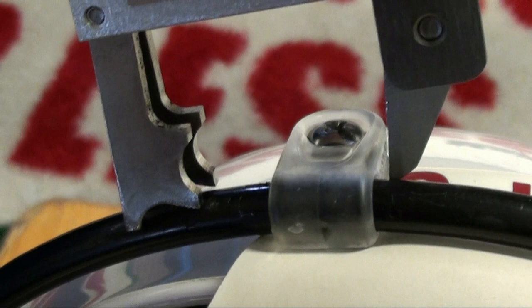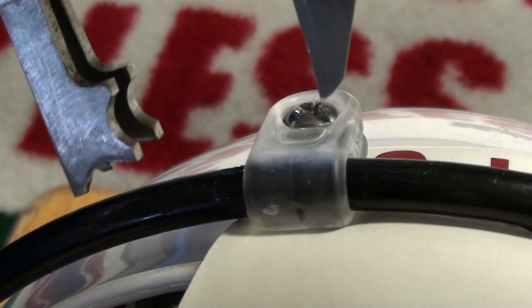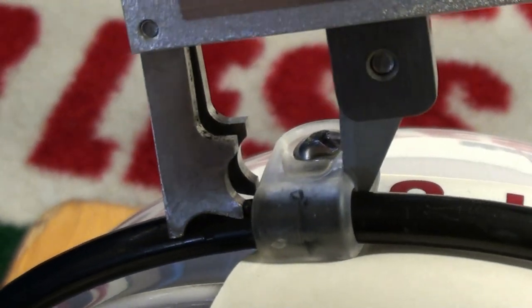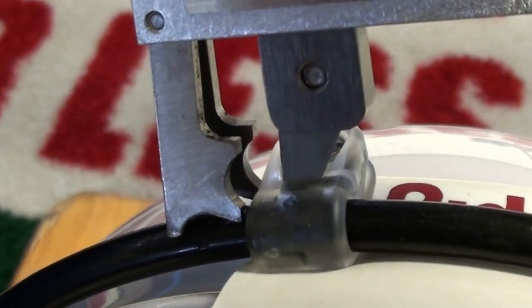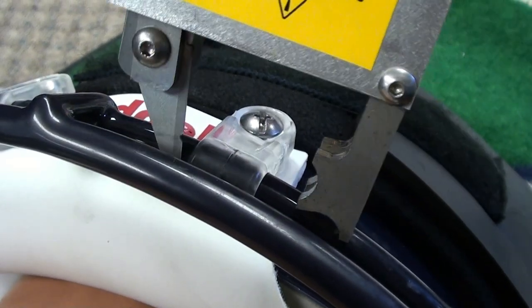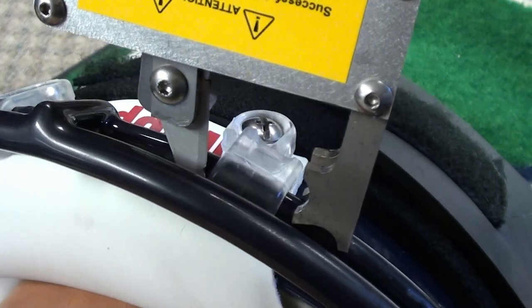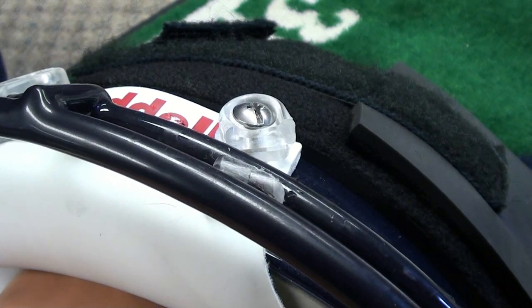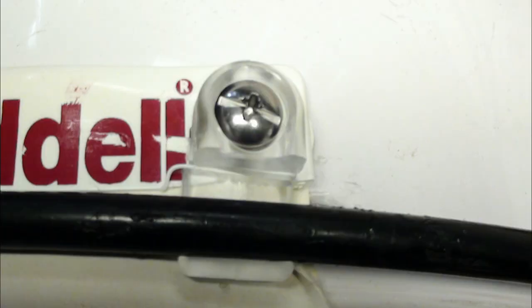You may elect to adopt a two-cut chasm nest technique for cutting through these forehead loop strap fasteners. Securing the anvil to the face mask bar using the superior chasm nest of the anvil on the face mask bar, reach the blade across the fastener, tip the blade forward to allow the anvil to grip the face mask bar, and cut the loop strap above the top of the face mask bar. Leave the anvil in place and rotate the handles of the FM extractor to gently pull the blade away from the helmet shell. With the anvil still secured to the face mask bar, place the blade below the face mask bar and make a second cut. These two cuts will result in a one-half inch piece of the fastener falling away, providing enough space for the face mask to be removed.